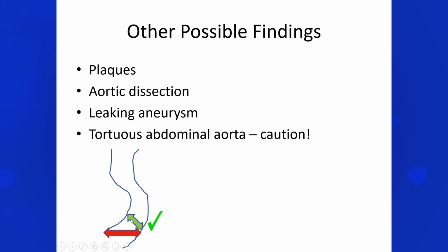So be aware that you should, when it's tortuous, and how do you know it's tortuous? You're not able to get a long axis view. No matter what you do, you're just not able to get a long axis view. So definitely be aware of that.